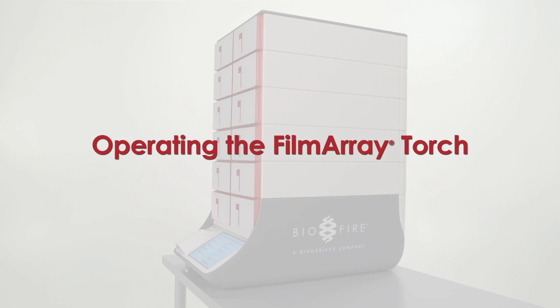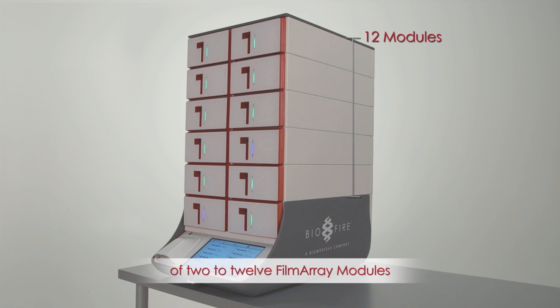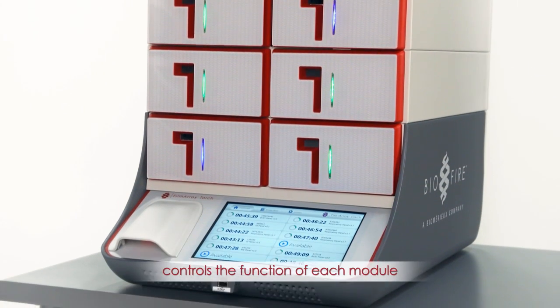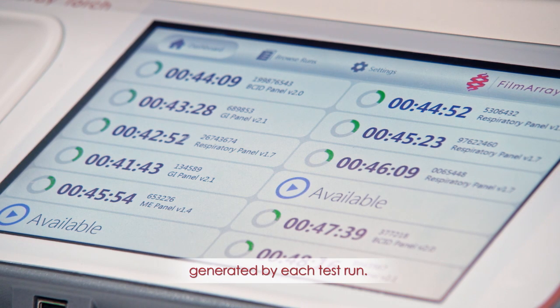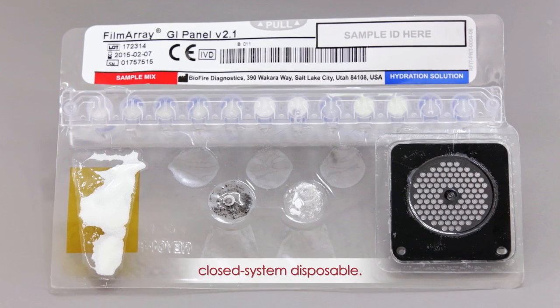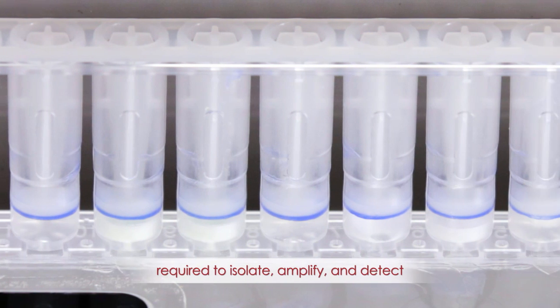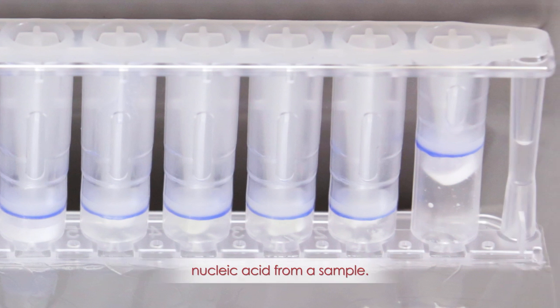Operating the FilmArray Torch. The FilmArray Torch is composed of 2 to 12 FilmArray modules connected to a system base. The FilmArray Torch software controls the function of each module and collects, analyzes, and stores data generated by each test run. The FilmArray Torch uses the FilmArray pouch, which is a self-contained closed system disposable. The FilmArray pouch houses all chemistry required to isolate, amplify, and detect nucleic acid from a sample.